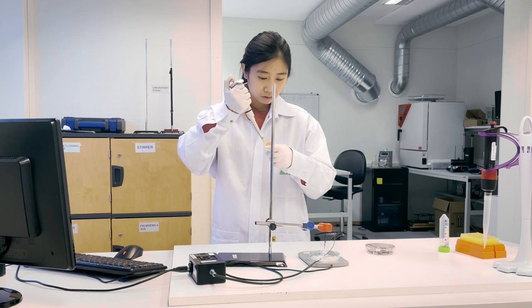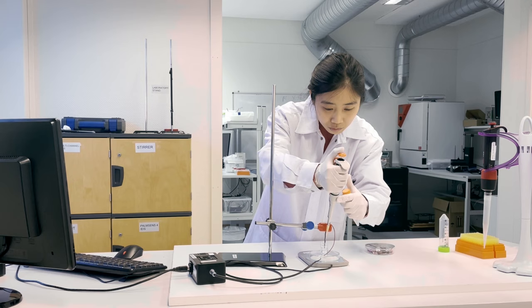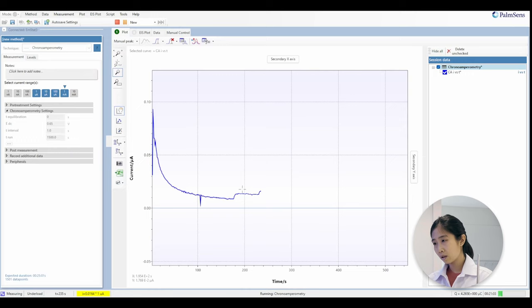Now we can give another spike to give another five millimolar increase. Again, don't put it too close to the electrode. Now you can see there's another increase in the staircase. So let's wait a little bit for the sensor to reach stability.